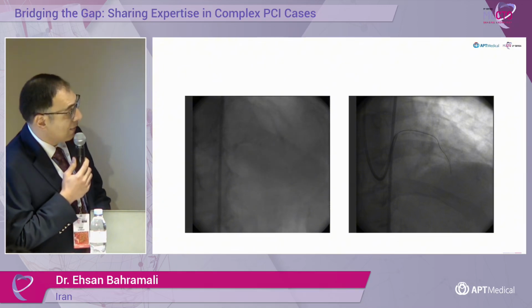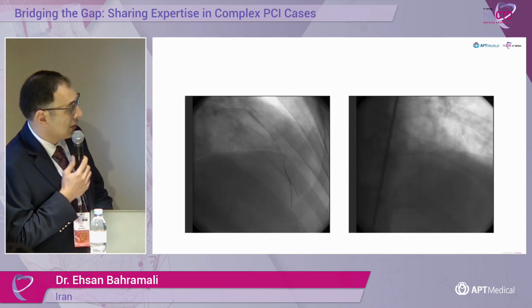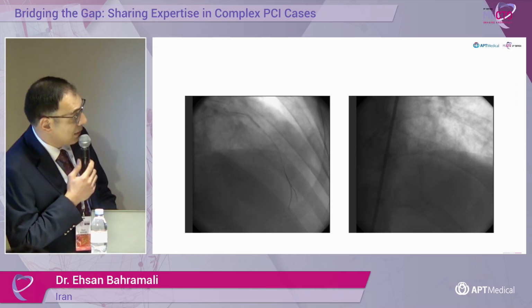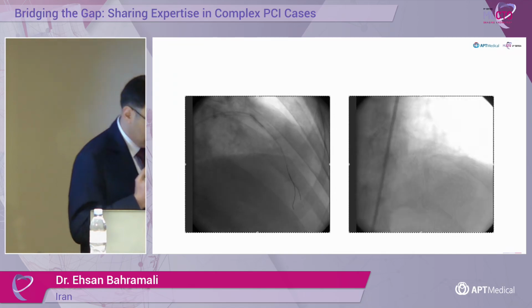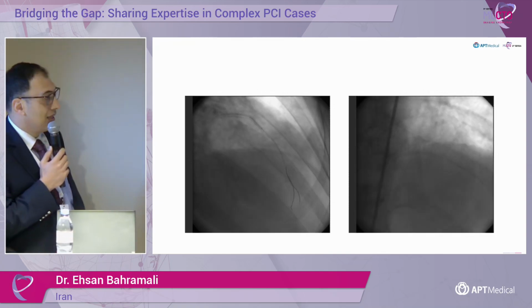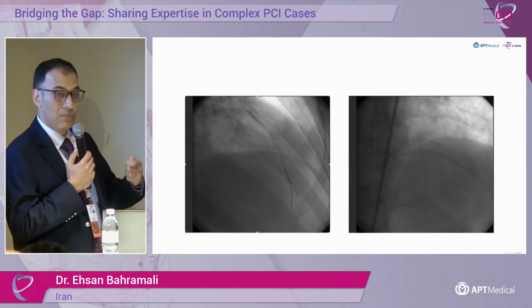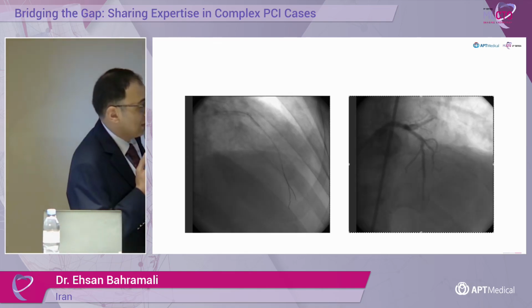He managed to go inside the stenosed artery with Gaia 2, and he passed a Corsair, and then there are 2 BMW wires inside LAD, and he started the predilation. And when he tried to put the stent with the help of buddy wires, this is what happened. In the left angiogram, you can see, I don't know if it is evident here, he pushed the Orsiro stent through the LAD, and he was trying to pull back the BMW to prevent it from being jailed there. And he said, I felt a little resistance pulling back the BMW. And when he came out, for some reason, he lost his first BMW as well.